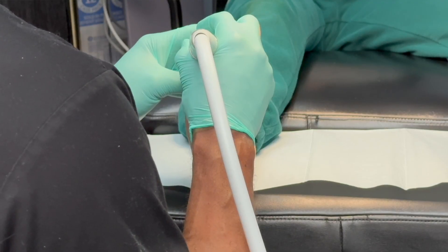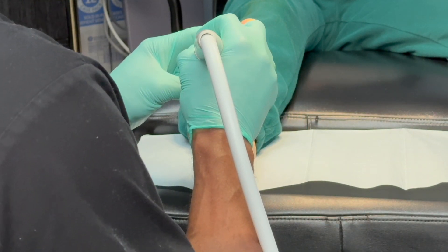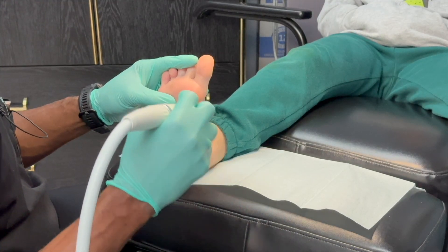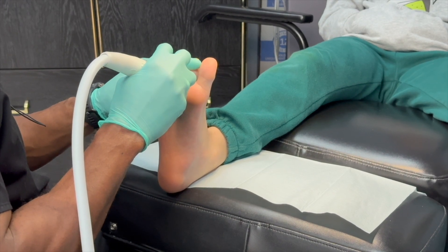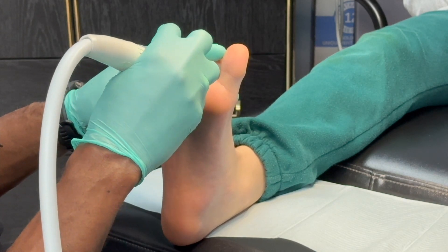One of the biggest advantages of Swift is how convenient it is. There's no need for anesthesia, no cutting or breaking of the skin, and no bandages or dressings afterwards. Most people can return to their normal activities immediately after treatment. You might feel a brief, mild discomfort during the procedure, but there's little to no pain once you leave the clinic.